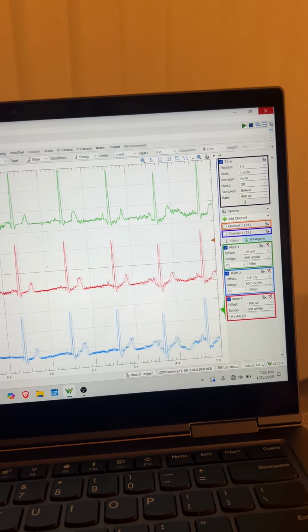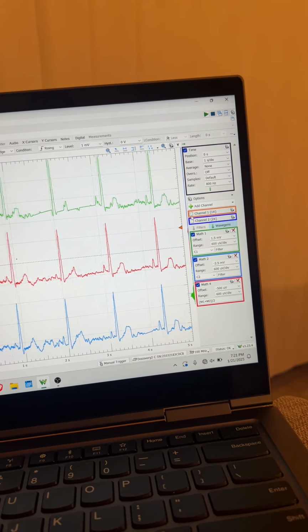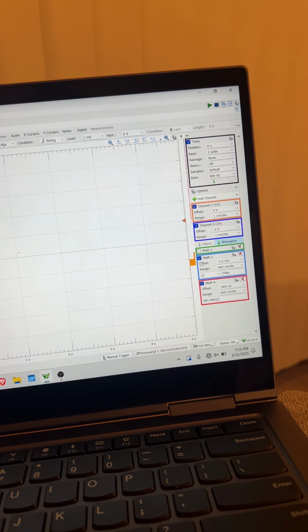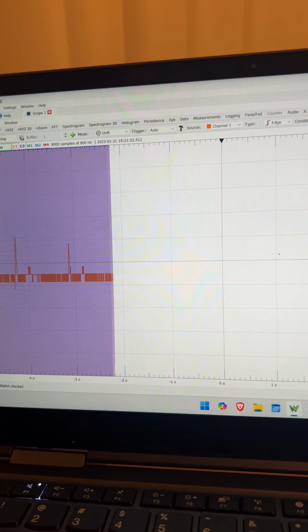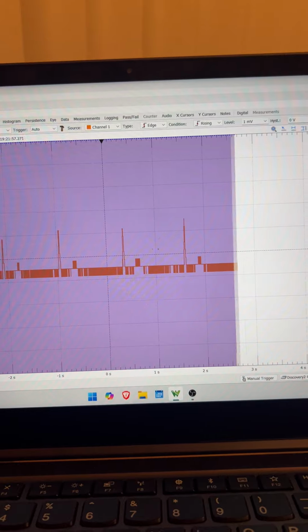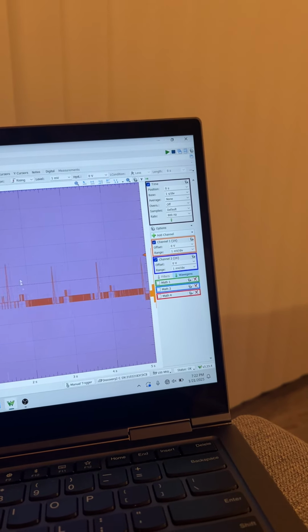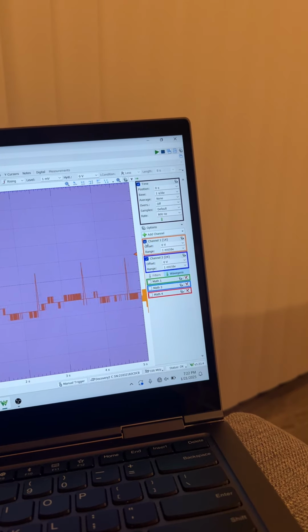To dive into a little bit more detail about the signal processing going on here, it's not overly complicated, but if I show you the raw channels here, let's disable our filtered channels and our average channel. You'll see that the signal is kind of hard to read to begin with. This is in a 1 millivolt per div setting, and you can see that the signal is basically just all over the place. If I were to zoom out more, you'd see even more chaos.